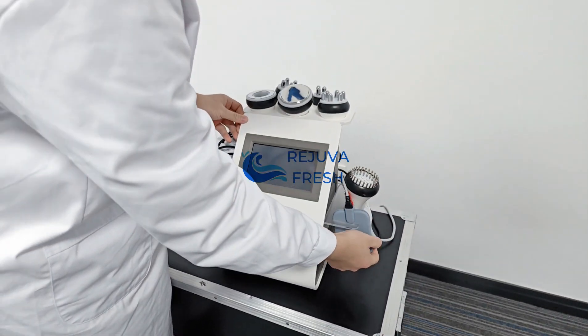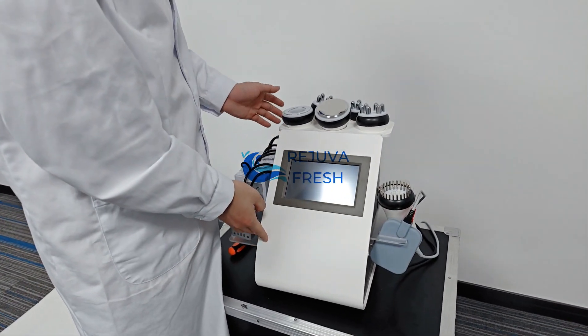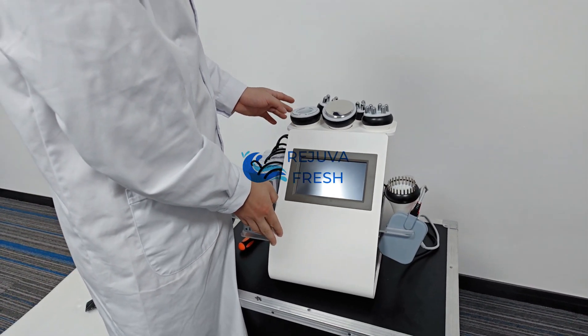And that's the whole installation video for the white handle 9-in-1 cavitation machine for toning and slimming.